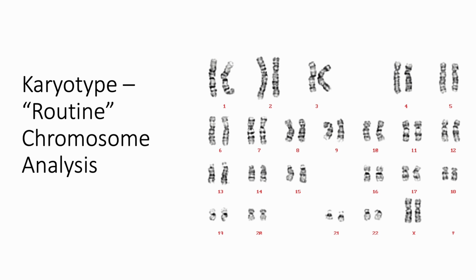Each band reflects areas of DNA that are either more tightly or loosely packed, aiding in the detection of structural changes like deletions or duplications. In the past, creating a karyotype was a very hands-on process. After staining the chromosomes to highlight these banding patterns, scientists would physically cut out pictures of each chromosome from a photograph, arrange them by size, and compare them manually. It was a painstaking task, requiring extreme precision and attention to detail.